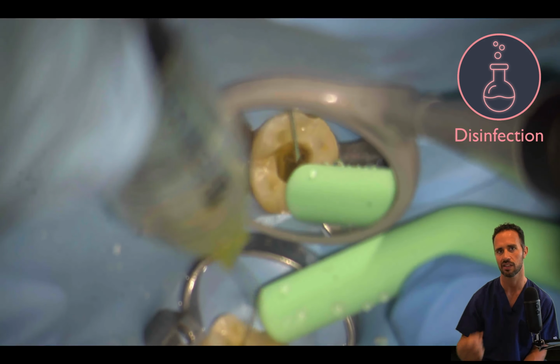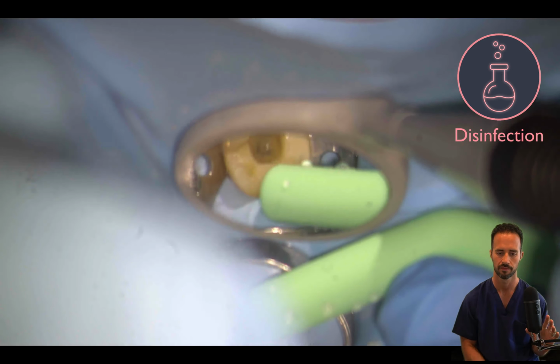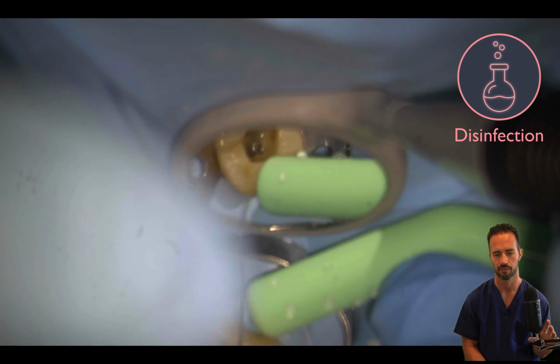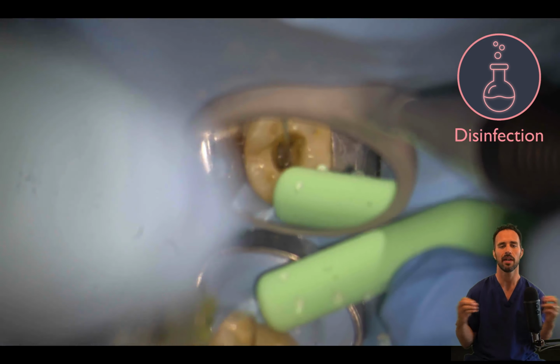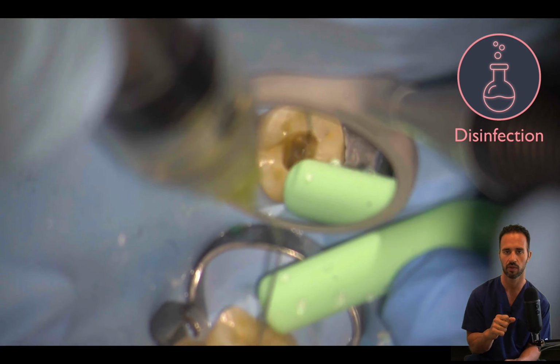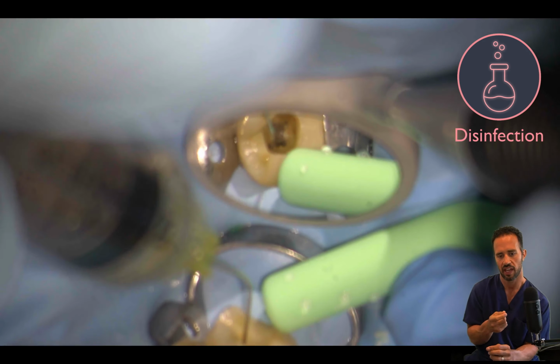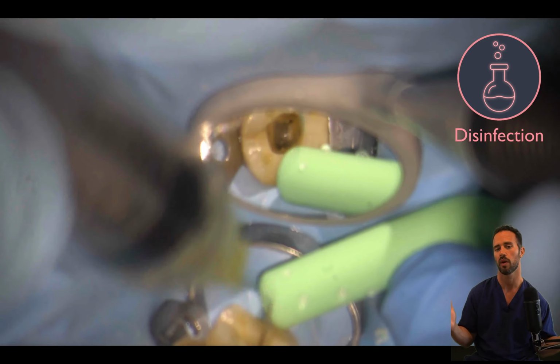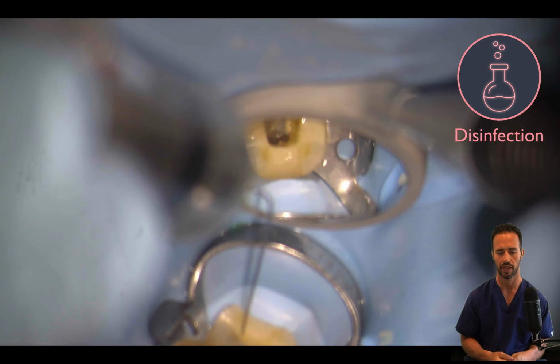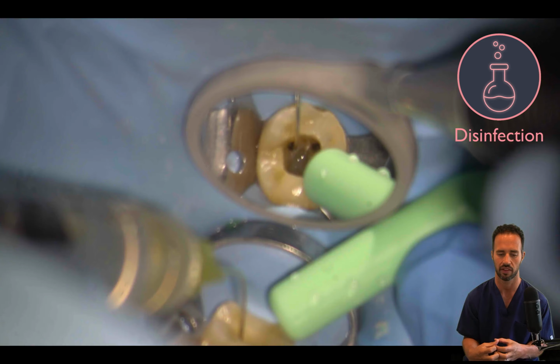So again, lots and lots of sodium hypochlorite in all 4 canals. Good. And then our last canal there. And remember, in an effort to minimize the number of paper points you use, we aspirate out the solutions, okay? When we're done utilizing it, we place it into the canal, we pull back on the syringe and pull out the fluids, and then we only have to use 1 paper point per canal, 99% of the time. There we have it. We aspirate it out, and you can see the distal canals are right on top of each other, indicating that they're completely merging.